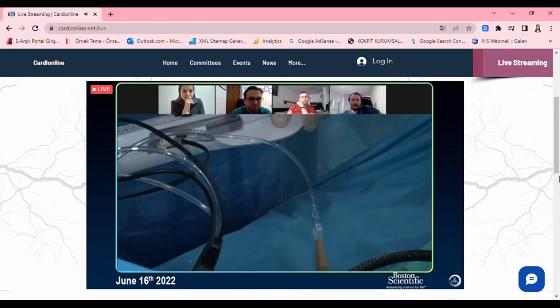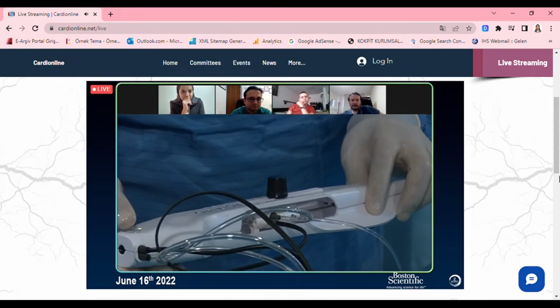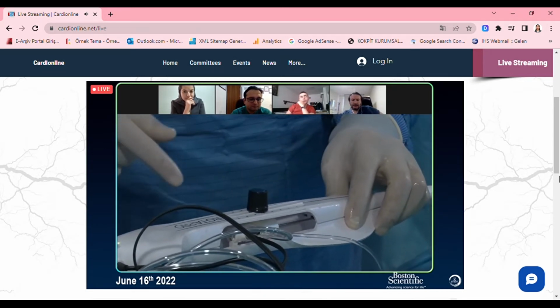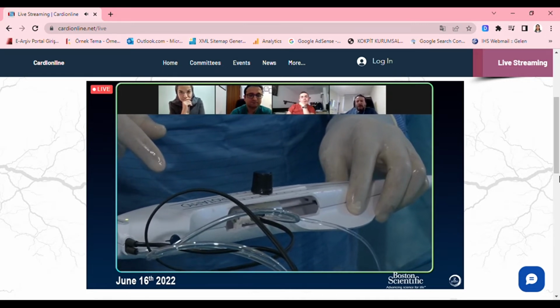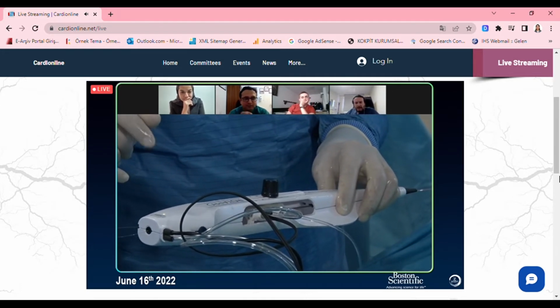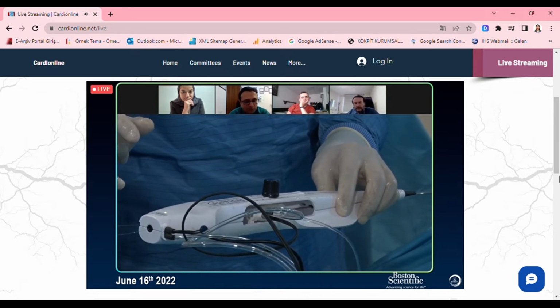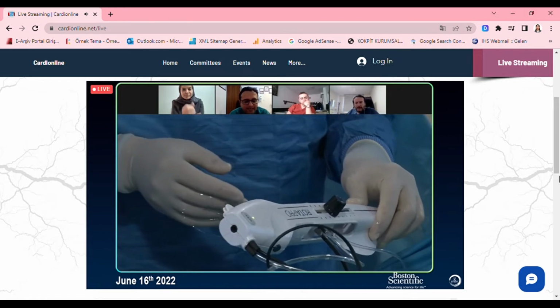We would like to have Dynaglide mode. Okay, we activate the Dynaglide. You see the screen we have in the Dynaglide. Any comment about the Dynaglide? I don't use a Dynaglide for going in. What about you, Esad? I always press the first pedal on Dynaglide before even starting burring. So I always go up and come out both on Dynaglide. But I don't go in on an activated Dynaglide.